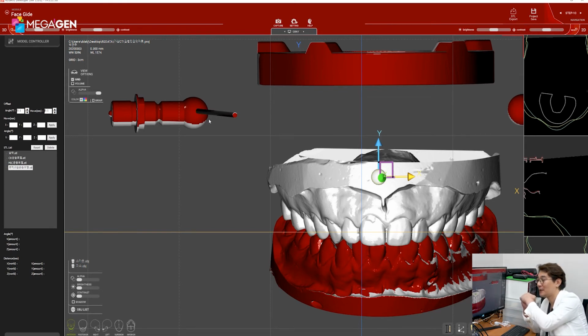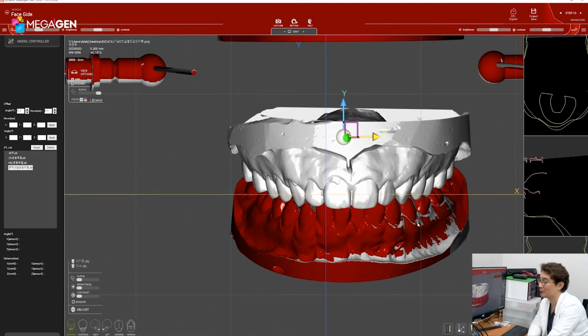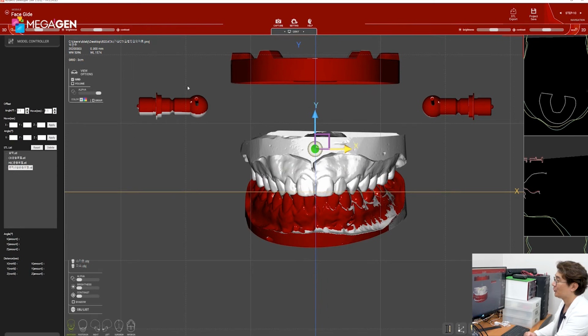That's why he feels some pain, and as a result, the jaw is a little bit shifted. This is a mandibular position indicator. So three-dimensionally, you can analyze the jaw position, not only the arch position, but also the condyle position like this. What are the treatment options?